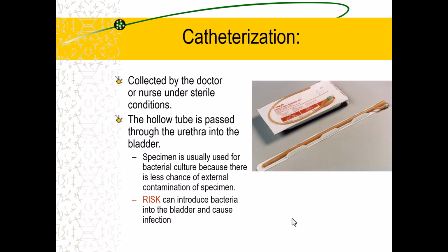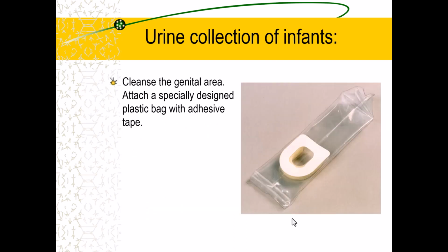Going back to the infant stuff, I read in a fairly outdated book that you can squeeze the diaper to get a sample. Is that still a thing anymore? Okay. Diapers have too many other things in them that are going to affect your results. They used to do that, especially with a regular cotton cloth diaper, maybe, but it still has so many limitations, and it's going to get so many fibers in it, and it's going to be a lot of problems. So it's not ideal.